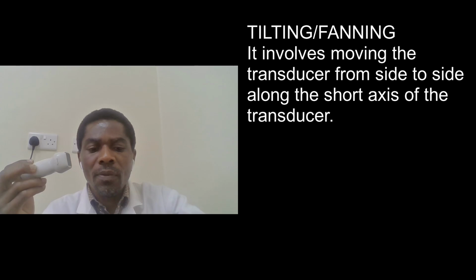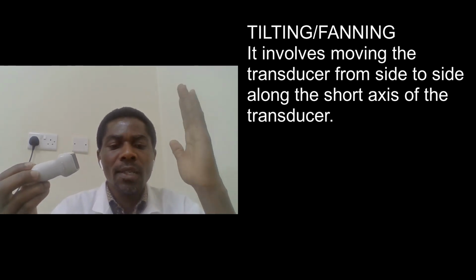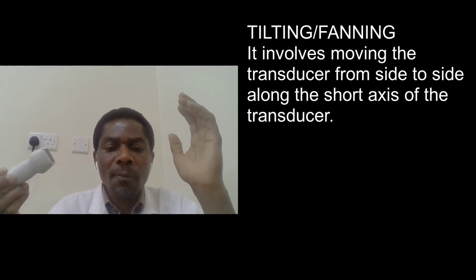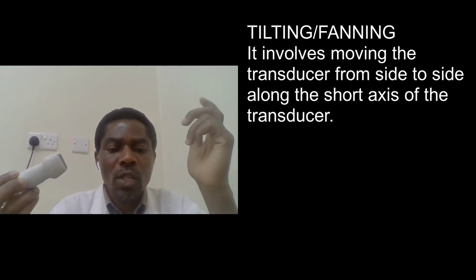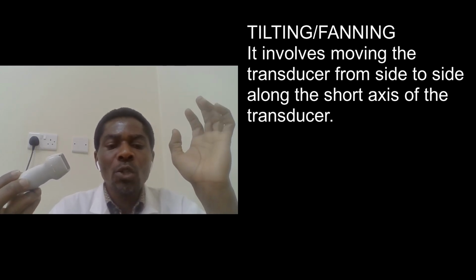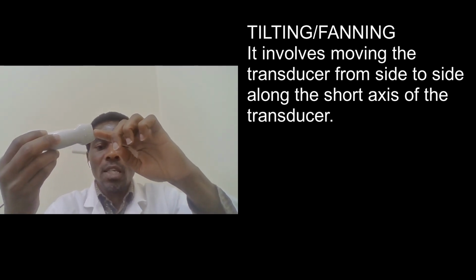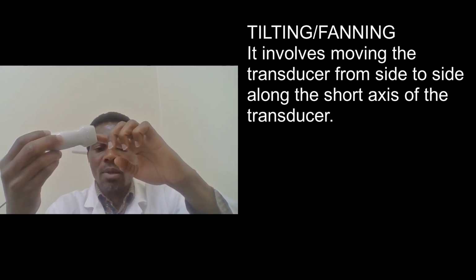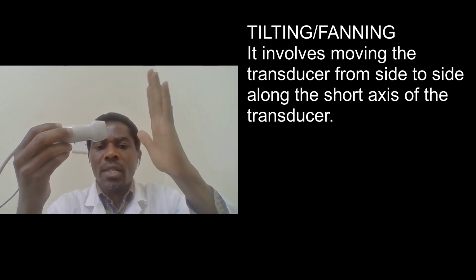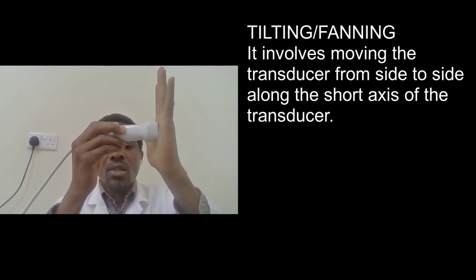Secondly, we have tilting, also known as fanning. So tilting involves moving the transducer from side to side along the short axis of the transducer. So this is the short axis of the transducer. So when tilting, you move it from side to side.